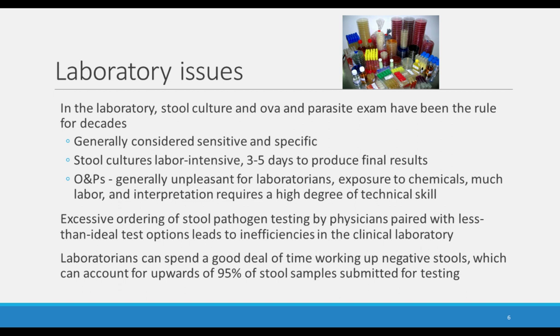But I've always thought that stool cultures were labor intensive. It can take 3 to 5 days to produce a final result. O&Ps, I have to admit, they were not always my favorite thing to do, and I think I share that with the people that I work with in my own laboratory. You have exposure to chemicals. It's a lot of labor involved, and you have a lot of interpretation that requires a good deal of skill.